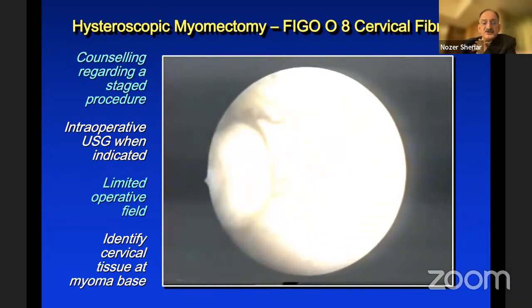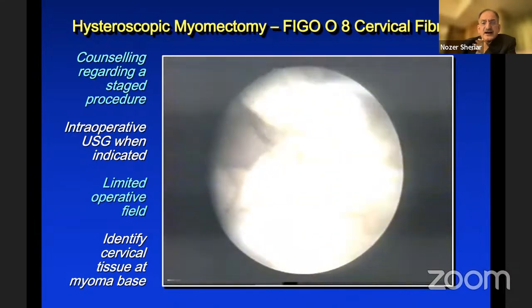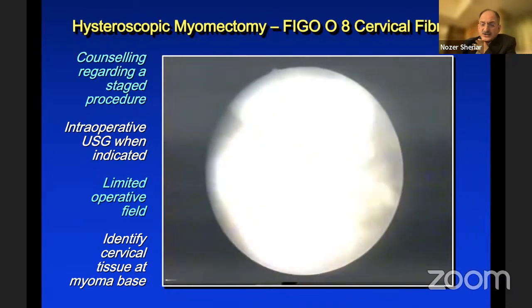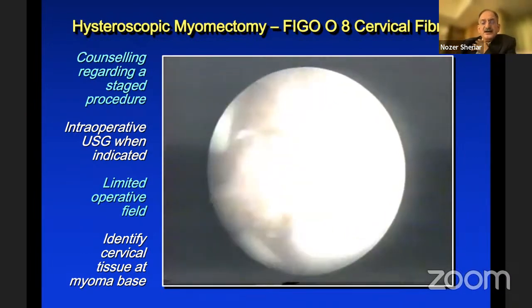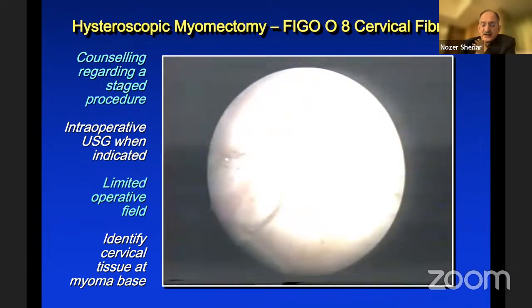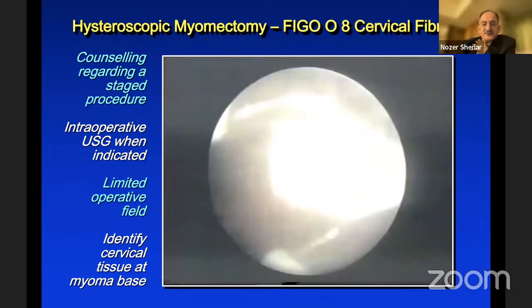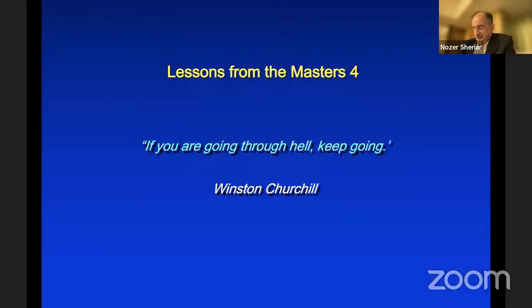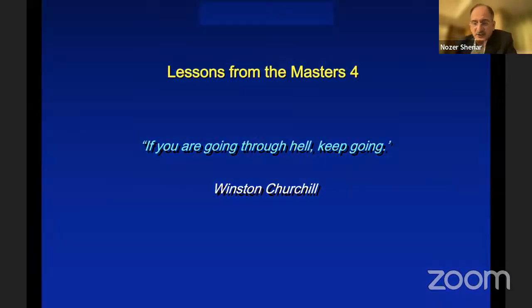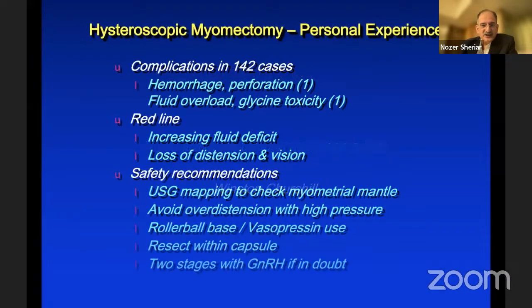We've also dealt with myomas which are almost completely in the wall. And if I know where the myoma is and I have got an ultrasound mapping, I can actually go for it. Now, the one thing I'll request participants here is please understand that this comes at a later stage in your practice of hysteroscopy. I believe every gynecologist should be a hysteroscopist, but when it comes to the difficult adhesions and the difficult myomas, please wait to hone your skills to a certain level before doing it. Finally, Winston Churchill has said, if you're going through hell, keep going. And trust me, hysteroscopists do go through hell from time to time.